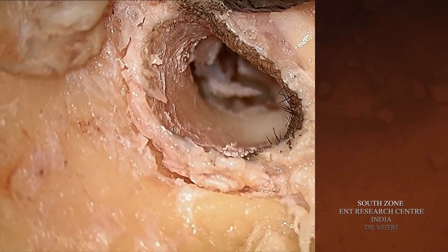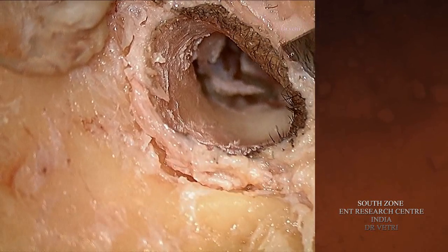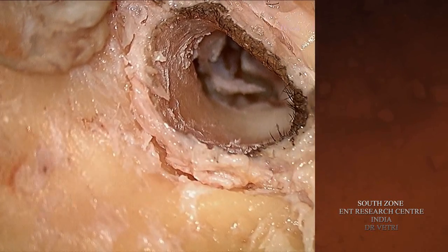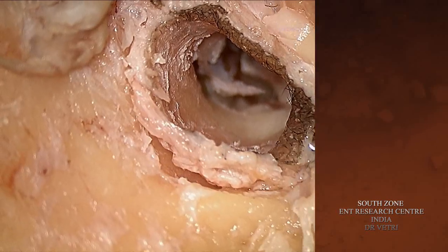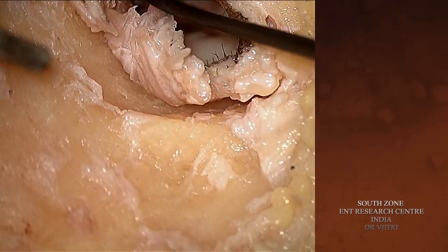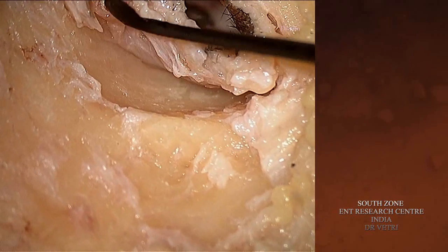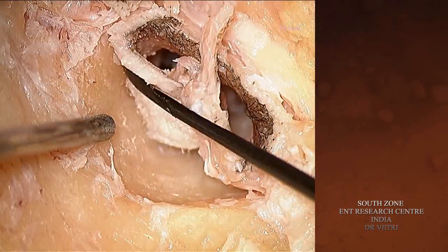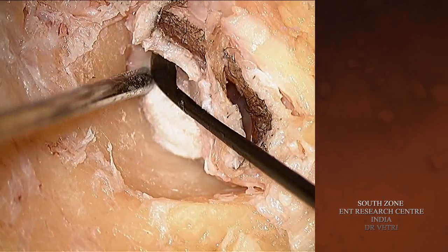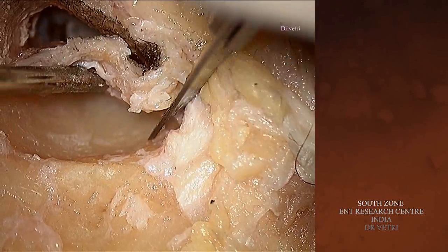And now the incision is given along the anterior canal wall skin. This exercise will be very useful for various types of tympanoplasty. Remember, already in this temporal bone, the posterior tympanomeatal flap has been elevated. So please understand that already there is an incision in the posterior canal wall skin.